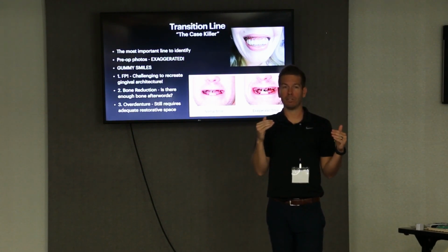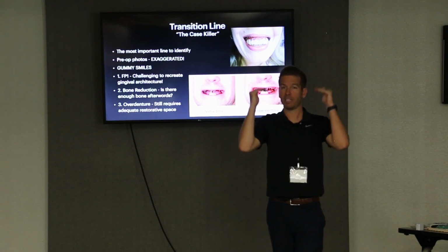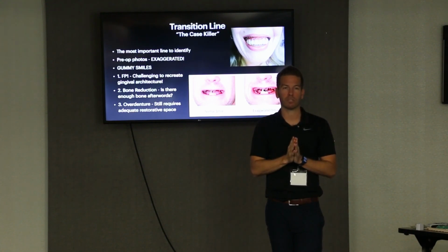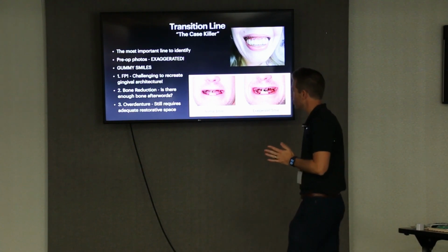And then you're looking at, okay, if I were to reduce the bone there, do I still have enough bone apically to that reduced position where I can support the implants that I need to support? If you can, then great. Maybe bone reduction is the right option.